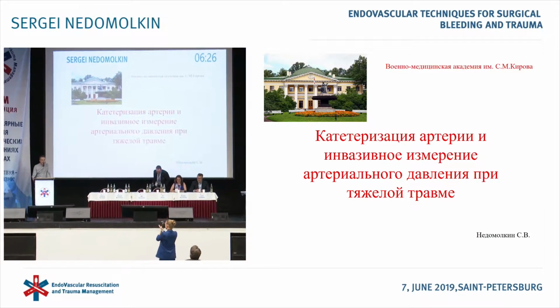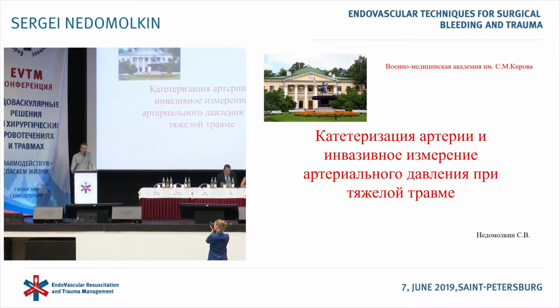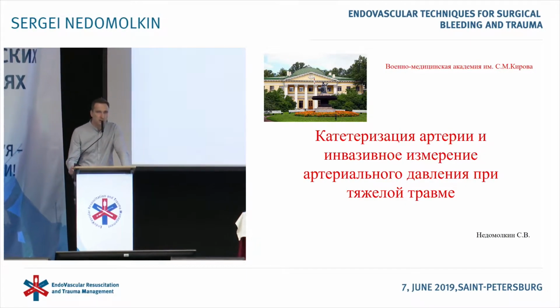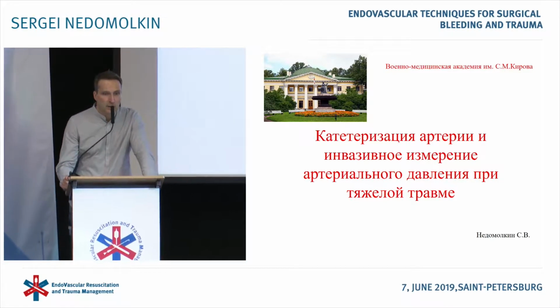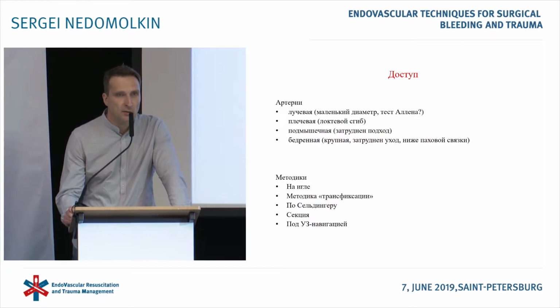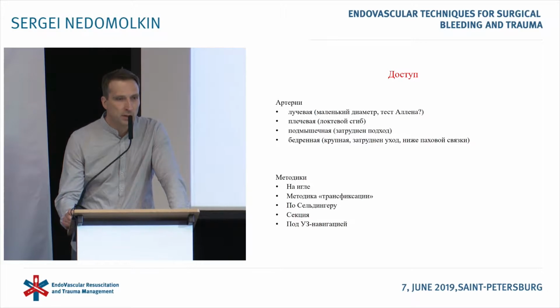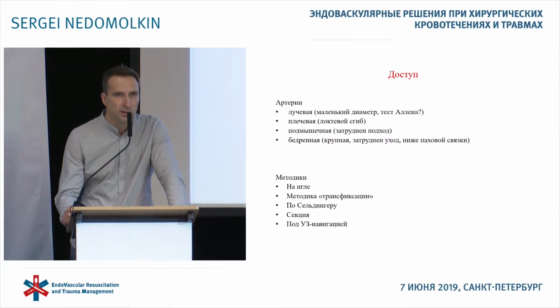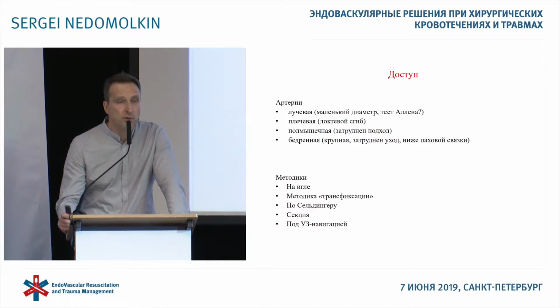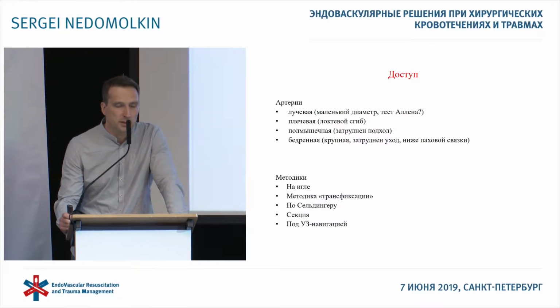And of course, we always have a possibility to see any changes in the arterial pressure. This is helpful because it helps to make decisions on the fast change of the strategy of treatment and follow-up of these patients. With all the advantages, measurement of arterial pressure, of course, has its downsides. We have to give away the technical possibilities, time limits, and also we sometimes compromise in favor of less opportunities in critical situations, in emergency situations.